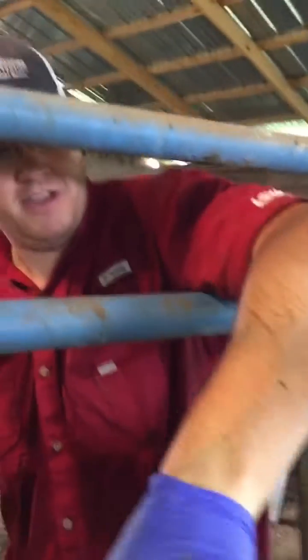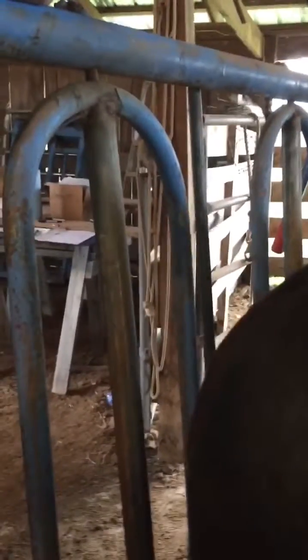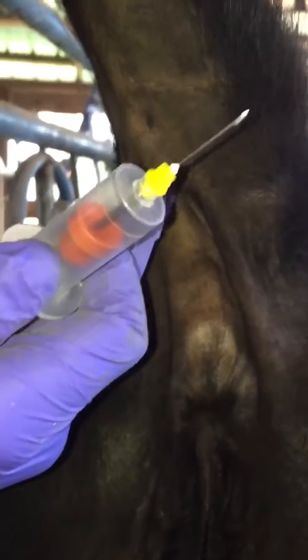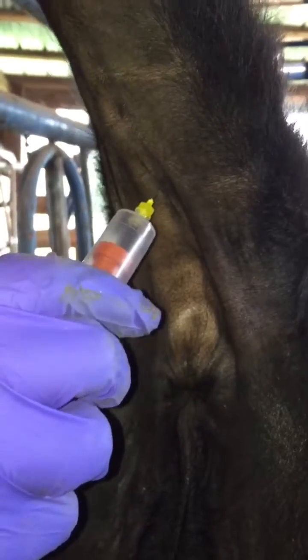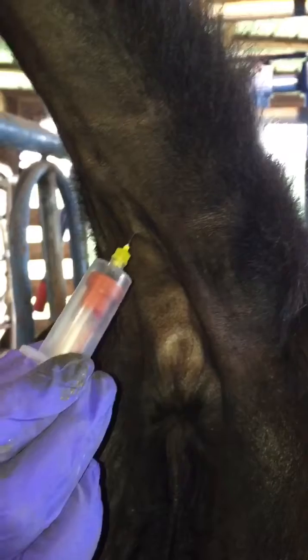The first thing you want to do is get their tail up about 90 degrees as best you can and untwisted. Then you've got this little two-sided container with the vacuum container — you can hold it all in one hand. You've got a flap of skin here and a flap of skin here, so you start at the bottom and right about here it's gonna meet bone. Come down back from that just a little bit, go in until you feel bone, pop your vacuum container in, and then back it off just a touch.